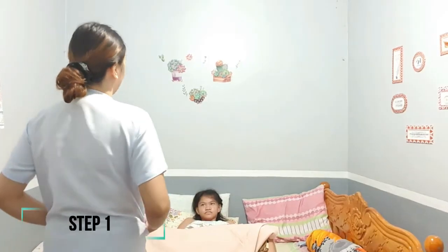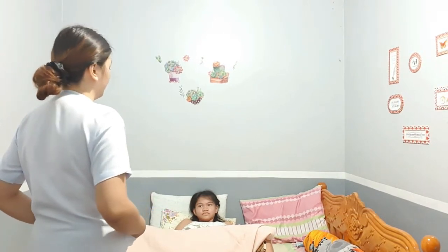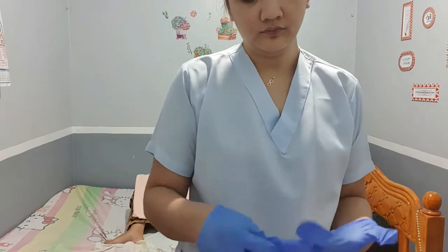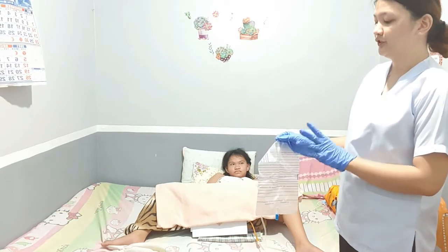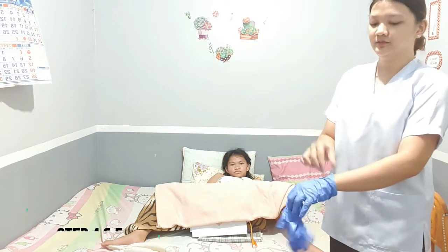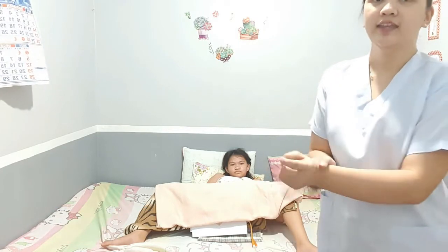Okay, good day ma'am. I am Marmar Cabigas, your student nurse for today. The doctor ordered you for the removal of the urinary catheter. Would that be okay with you? Yes. Next, I am going to perform hand hygiene and put on clean gloves to prevent any contamination. Next, we're going to measure, empty, and record the content of the urinary bag. Then remove our gloves, perform hand hygiene, and apply a new pair.